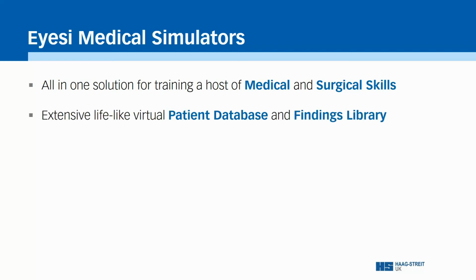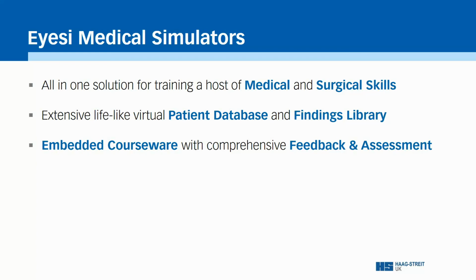The lifelike nature of Eyesi simulators really does have to be seen to be believed, and the extensive database of cases, as well as the ability for learners to store and return to their findings, make it a truly effective learning experience. The embedded courseware with thousands of hours of development behind it and contributions from hospitals and universities is of an incredibly high standard, and the comprehensive feedback and assessment allows students, educators and administrators to track and support individual student progress.